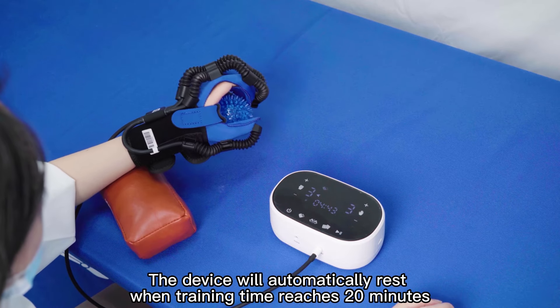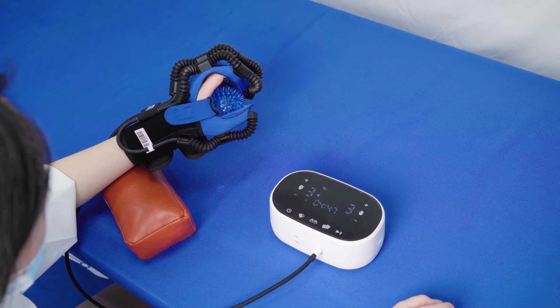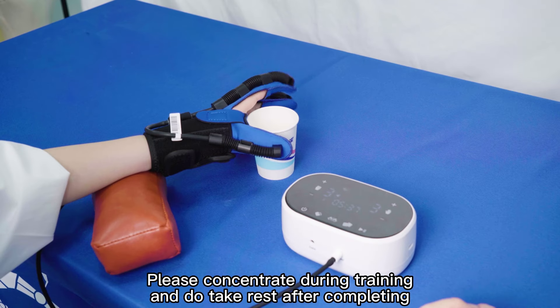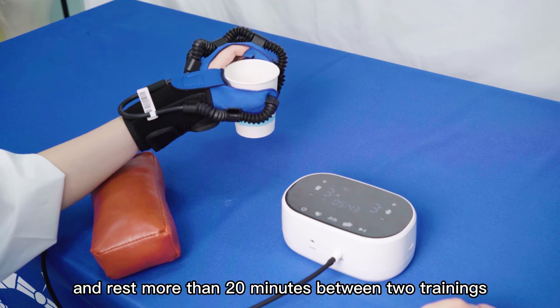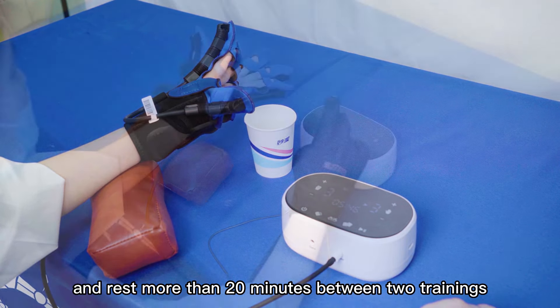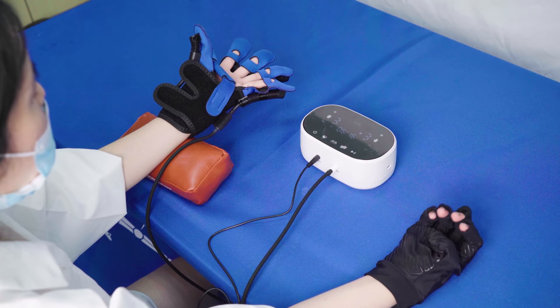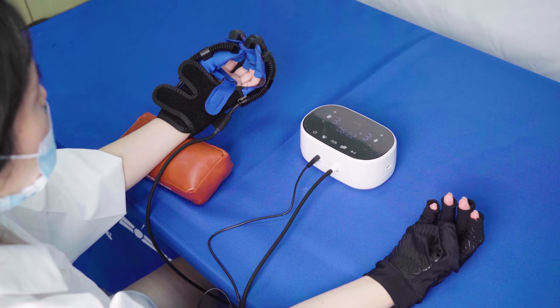The device will automatically rest when training time reaches 20 minutes. Please concentrate during training and take rest after completing training two to three times a day, with more than 20 minutes of rest between two sessions. Please persist in your training for better recovery.